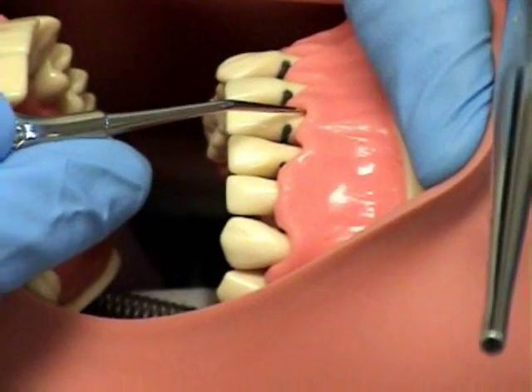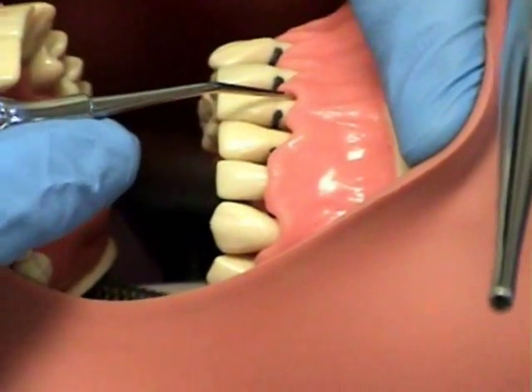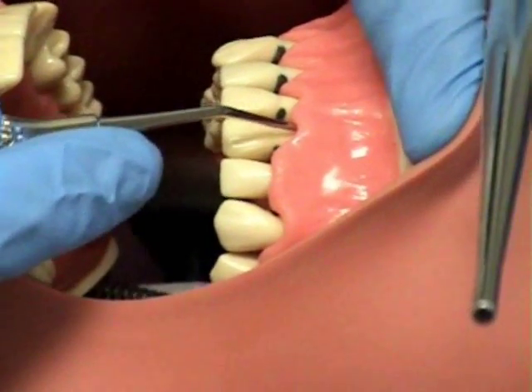This is the last instrument in the 4 series of debridement curettes. It is the SOH78. It has a 15 mm shank, allowing access into deep periodontal pockets.